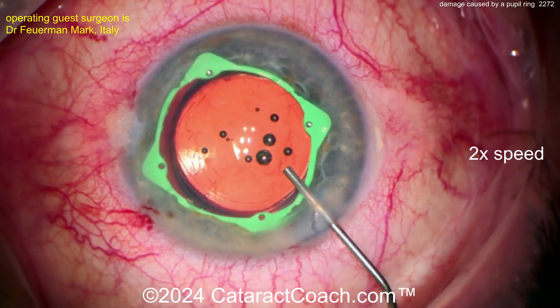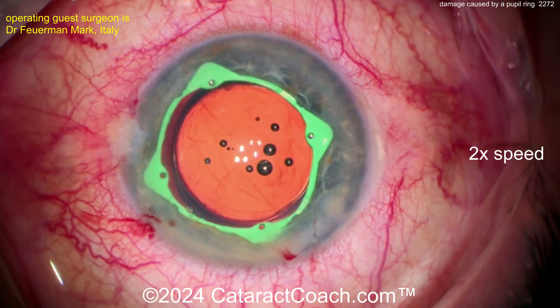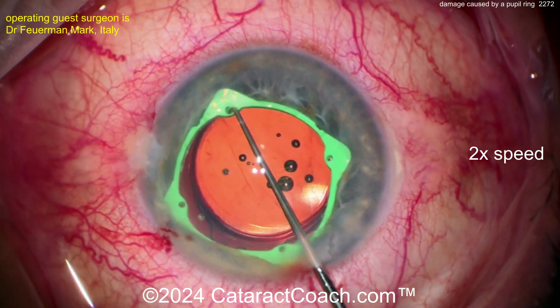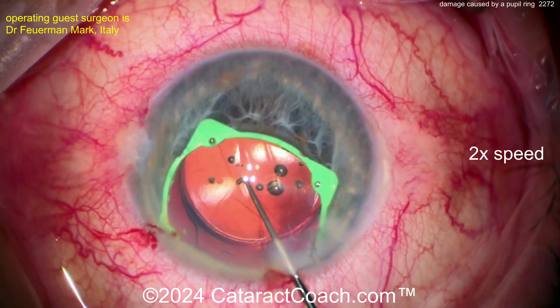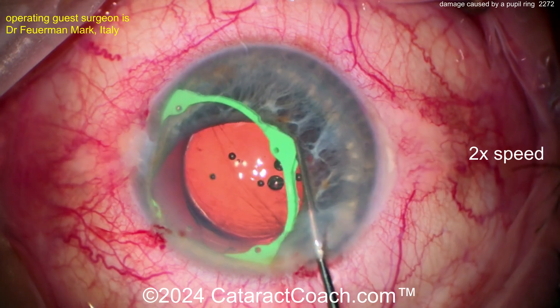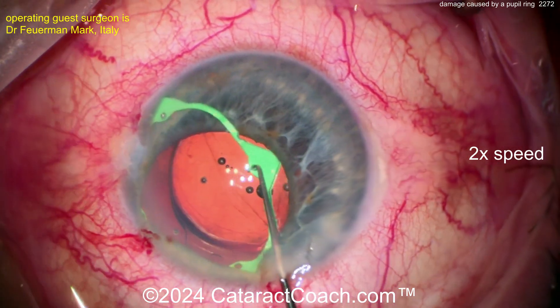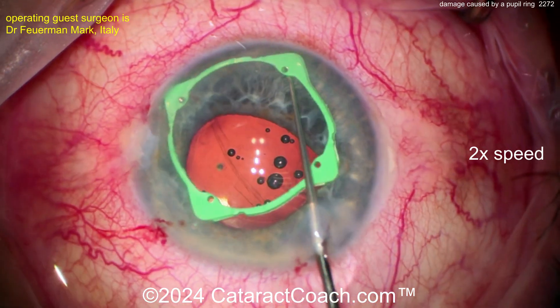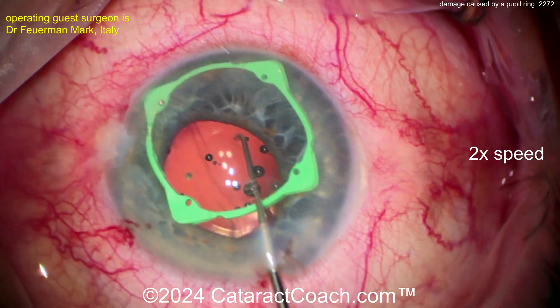Let's get that viscoelastic going in the eye. Let's get the ring out. Watch carefully. Now, getting it off the pupil margin, nice and easy. Get that over there on top. Get that one out too. Disinserting the iris or pupil margin from each of those little segments — that looks pretty good, it's freed up.